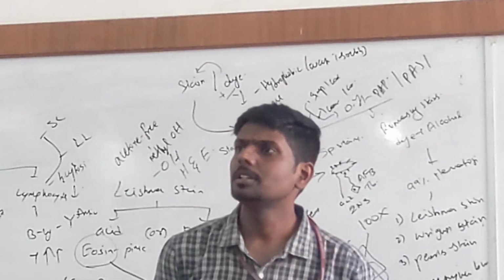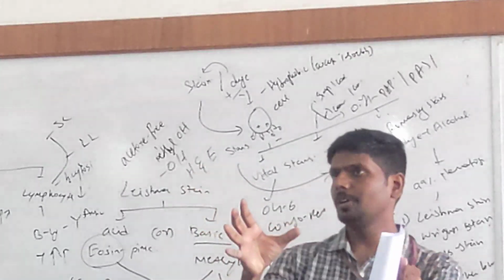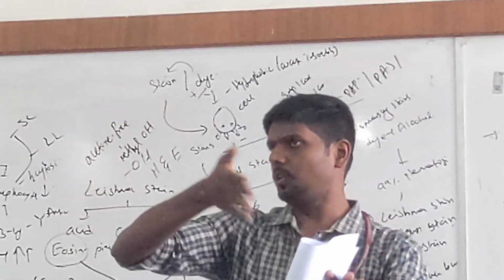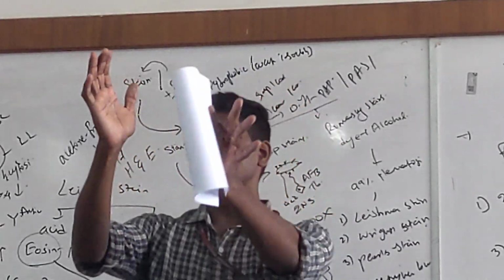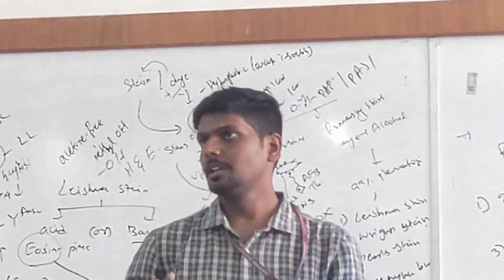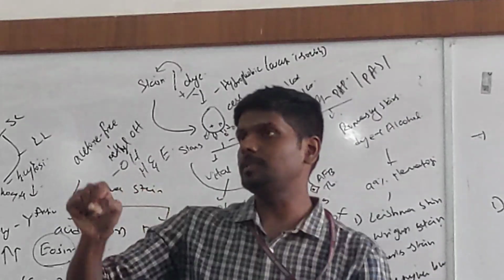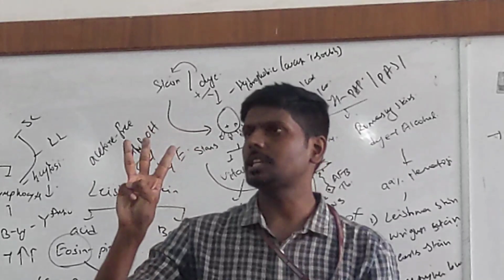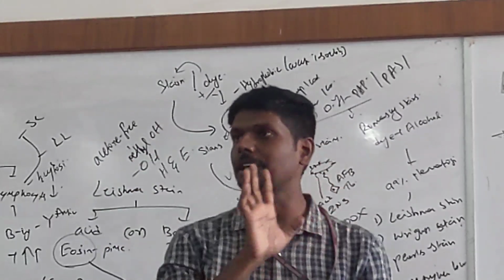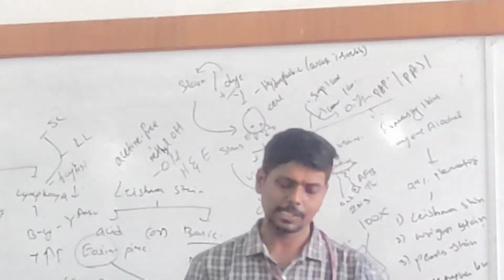How to count? Simple. You get one field of the microscope. There you can clearly see neutrophils, basophils, everything are visible. So in your field, how many neutrophils are present? If you see 7 neutrophils in your field, you will write 7 times N in the boxes. Then you saw 3 lymphocytes. You will understand once you are checking in the microscope. Easy.